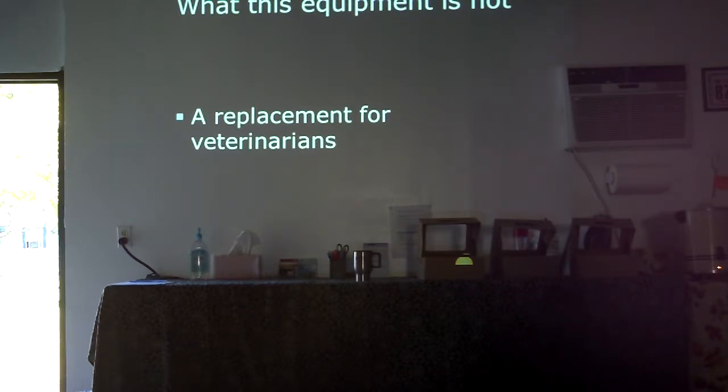So for instance, a lameness that might have been a little bit confusing in the past becomes less confusing, so there's less time trying to decide what to do. Also, sometimes I do many fewer activities now with the horse during my lameness evaluation, like flexion tests and lunging. If I can measure the lameness, even if I can't see it, with the horse trotting up and down in a straight line, that's what I do. I don't go do all the other stuff.